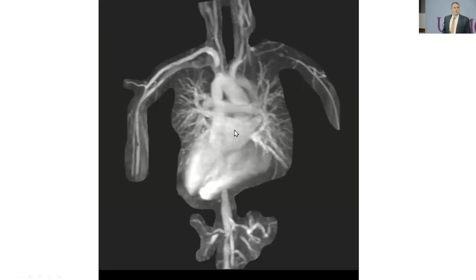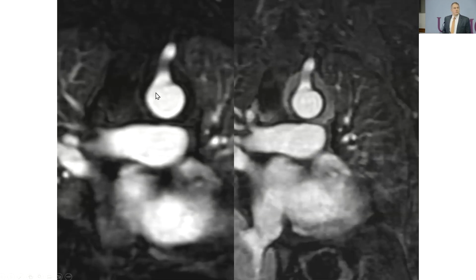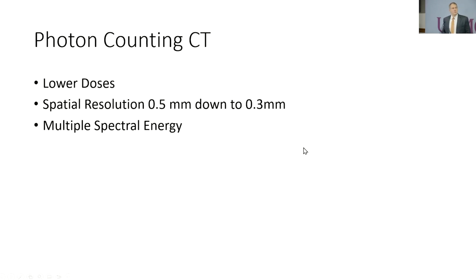I did want to mention vasculitis protocols. We use this. We do delayed imaging, so you can see CT is rather nonspecific, with some periaortic fluid or tissue. You can really get a good idea of enhancement of that periaortic tissue with MRI. This is MRI before contrast and with contrast. And the benefit of gadolinium is it's much more sensitive in terms of small levels of gadolinium around.